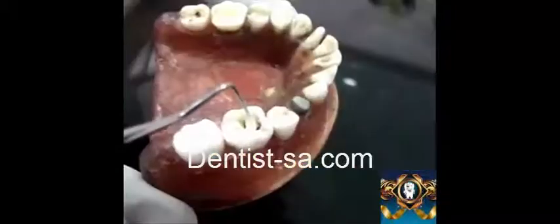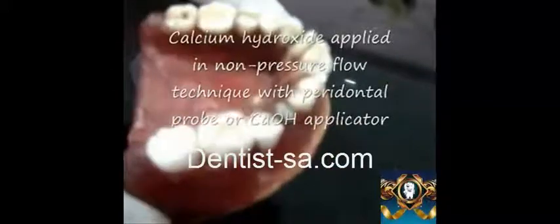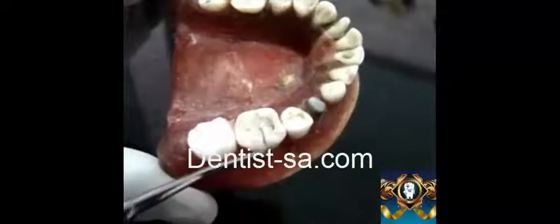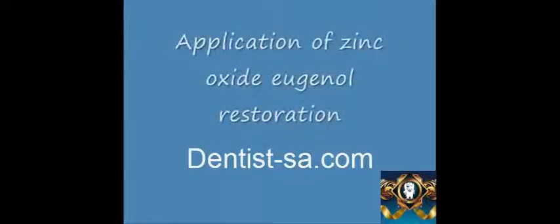Once this procedure has been done, the next step will be application of a calcium hydroxide liner. This can be done using a calcium hydroxide applicator or using a periodontal probe, as we have done here. This is mainly done in a non-pressure flow technique.